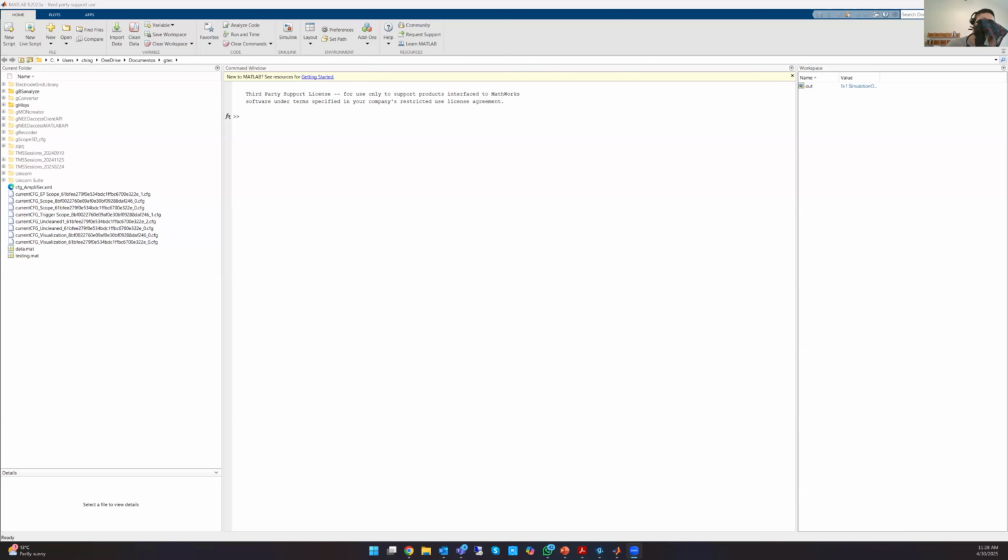The hole in the middle, you can easily use a syringe, add some gel in the middle to fill it up. Then it will transform into a gel-based electrode type. So the good thing is you can easily switch between dry and gel base, which makes this cap really easy to use.